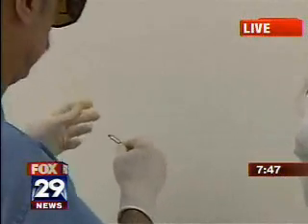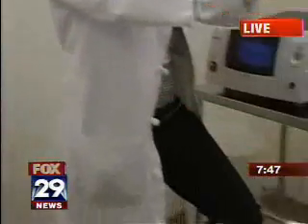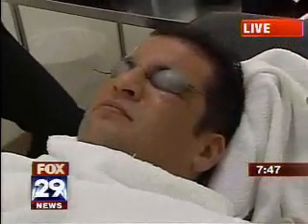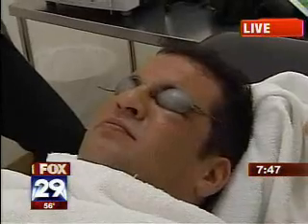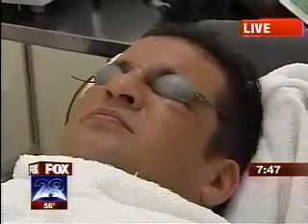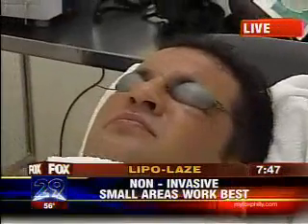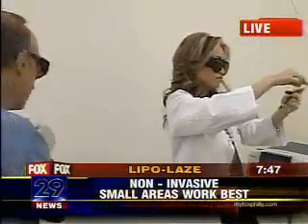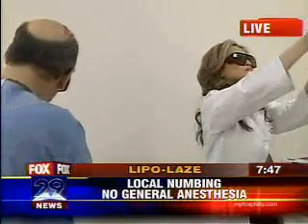One of the things that we talked about earlier, you like this because you can dissolve fat in there, and then where does it go? Or you tighten it up? Well, in this particular use of it, the fat literally gets vaporized. It just melts. And it's not a lot of fat, so there's no place to send it, if you follow what I'm saying.